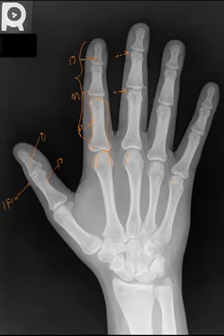This will be the proximal interphalangeal joint, while this is the distal interphalangeal joint. This is an important thing to note simply because digits 2 through 5 have three phalanxes and therefore two joints between them. Now, the distal phalanx has a very pronounced feature, is semi-bulbous in appearance, and this is the distal tuft. This region can become important in certain conditions that can cause resorption of the bone directly under the tips of the fingers.